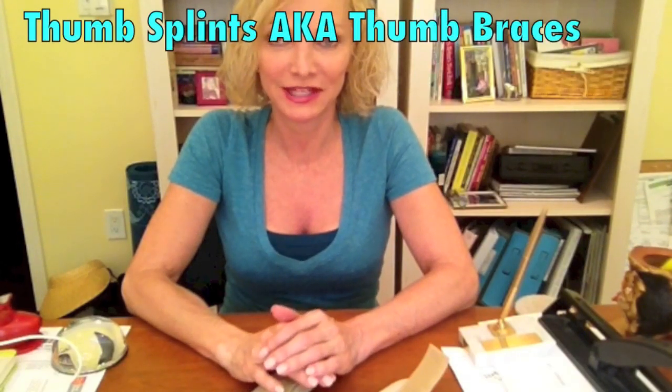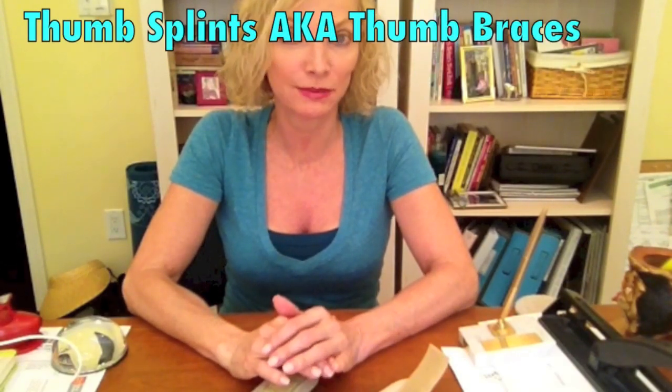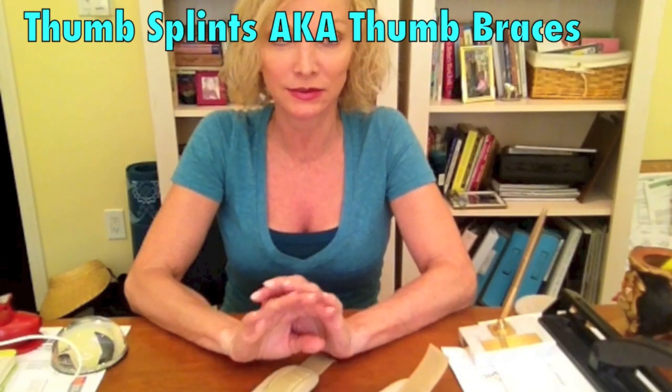Hey there, I have a lot of information for us to cover — three different splints that I want to tell you about. These are not to be mixed up with carpal tunnel splints; that's completely different. These are thumb splints for basal joint arthritis, or thumb arthritis.